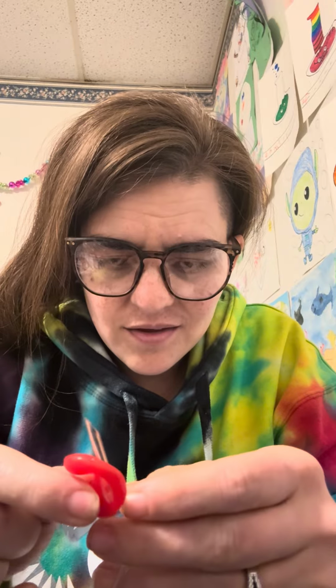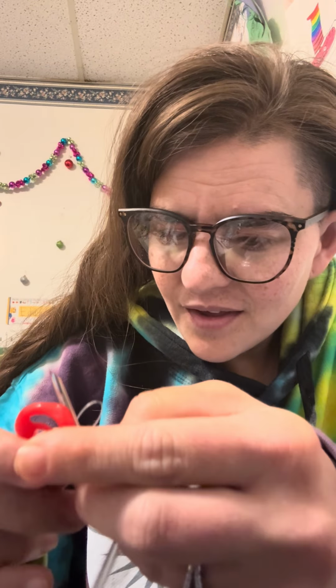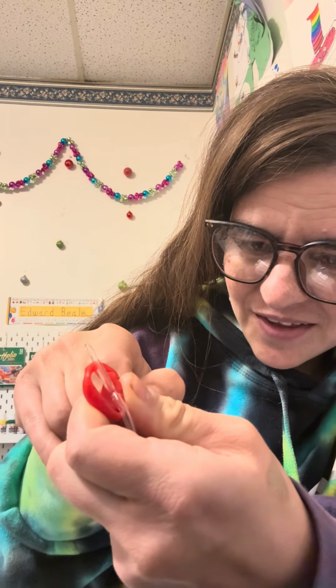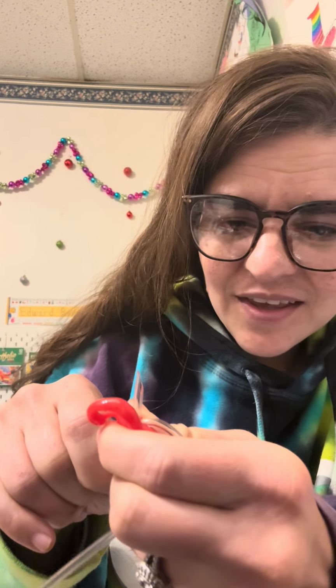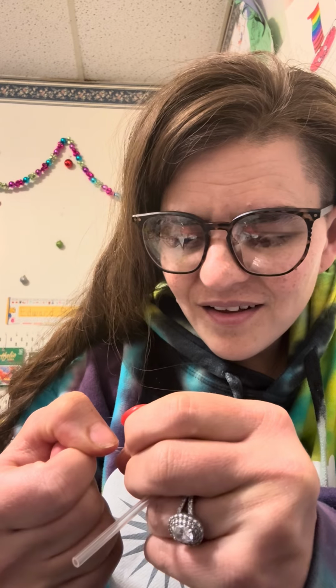Keep pulling it taut. Now watch what happens. I'm going to angle it so you can see it. Keep pulling it. Don't worry about hurting it. It's not going to hurt it. Just keep pulling it.